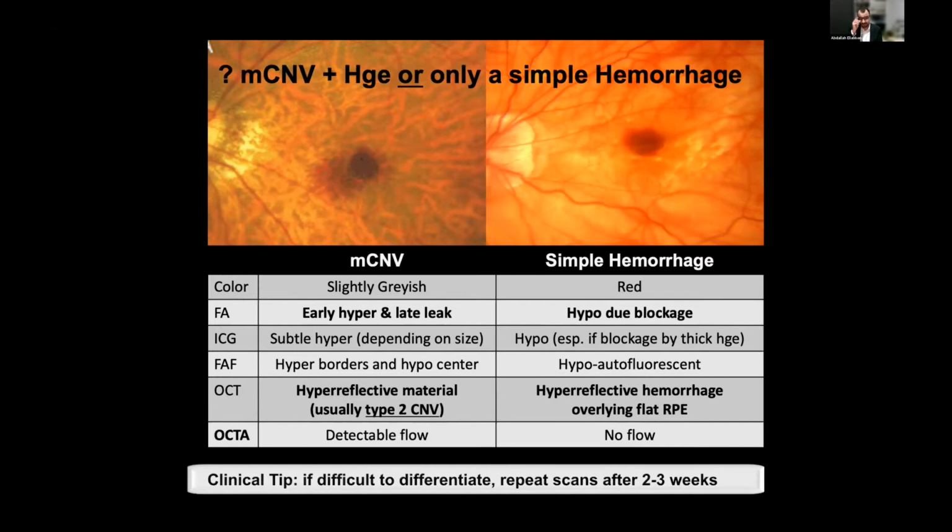And my clinical tip here is: always wait. You can wait for 2 or 3 weeks and repeat the scans. And if it's a simple hemorrhage, usually it will slowly resolve over time. But if it's a myopic CNV, it usually will cause further leak.